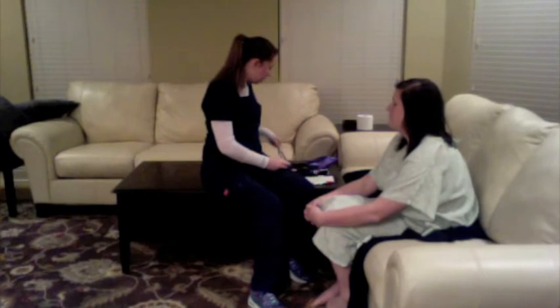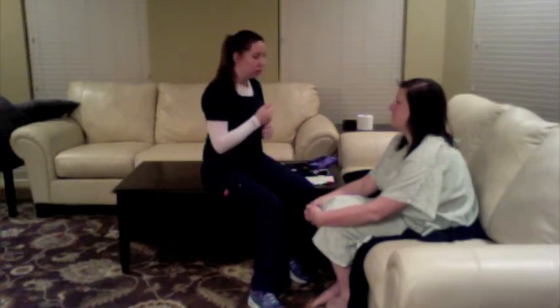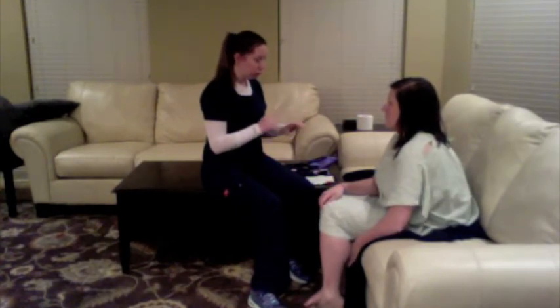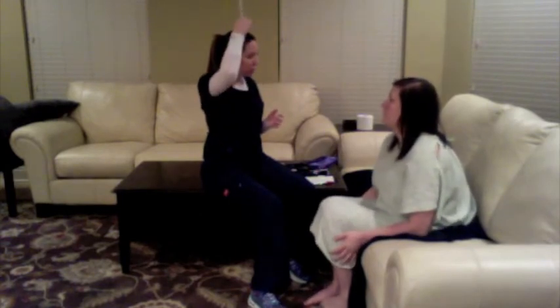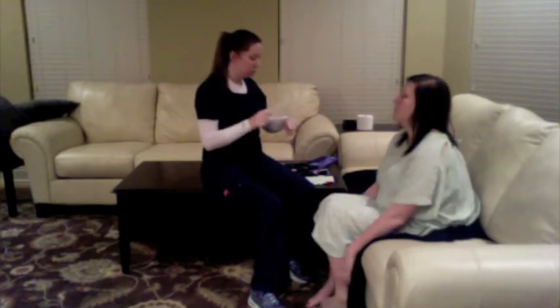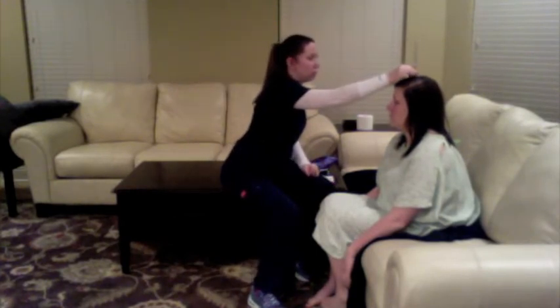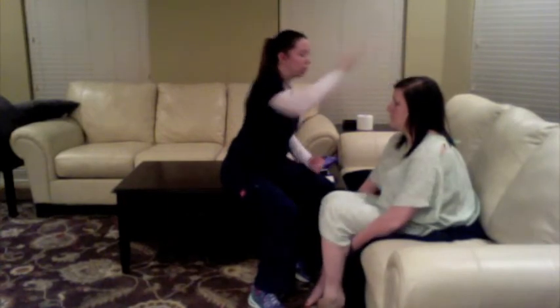Okay, now we're going to do some tests on your hearing. We're going to do what's called a Weber's test and a Rinne's test. What I'm going to do is use this little tuning fork. I'm going to strike it, and it's going to emit some vibrations. And we're going to put it on top of your head, and that'll determine if you hear good by air conduction and if you have balanced hearing on both sides. So we'll do this first. Can you hear both sides, or is one side louder than the other? Both sides. That was the Weber's test.